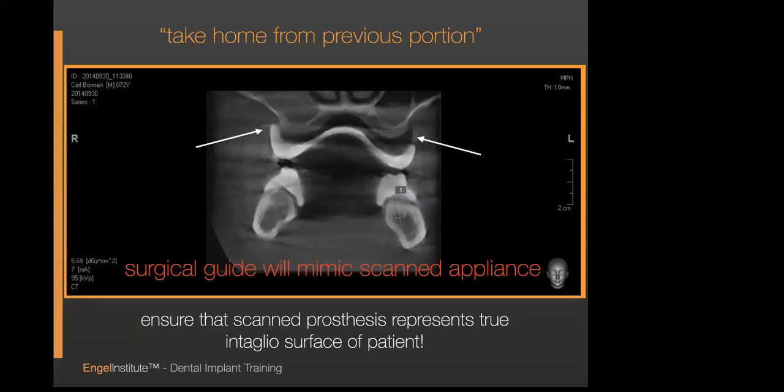About 15% of us will actually go and purchase some type of software, which I do not do because time is my commodity. This software that you're going to be looking at today, Diagnostix, has actually done the most guided implant surgery designs ever since the inception of this. So it's quite a great software. About 15% of us would design our own cases and then send the file off to 3D Diagnostics, and for less money, they'll print a guide for you. And then there's 4 to 6% of us that do it all. And if you are doing it all, that's great. If this is your first or second or third surgery, I highly recommend that you rethink that.